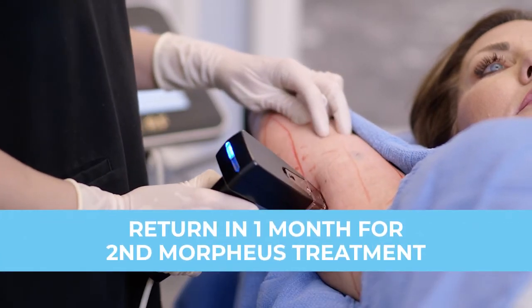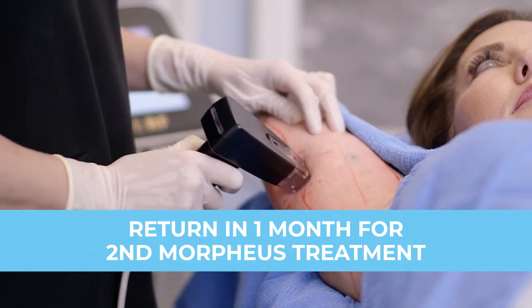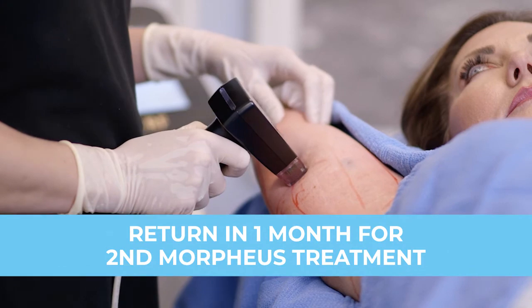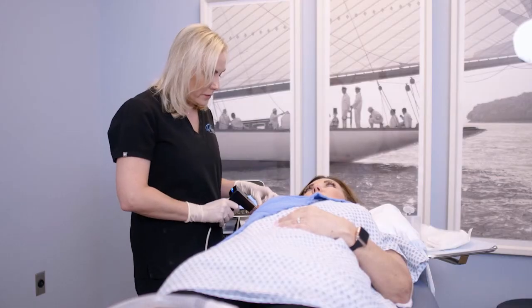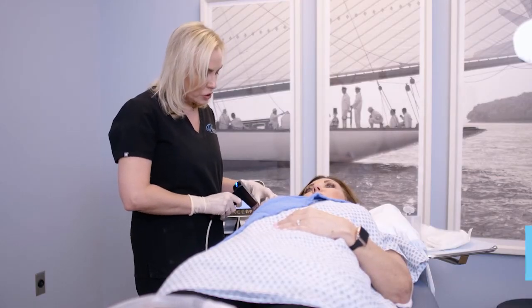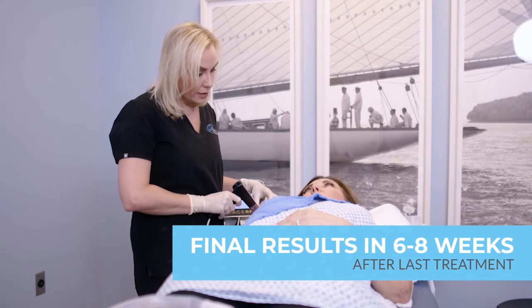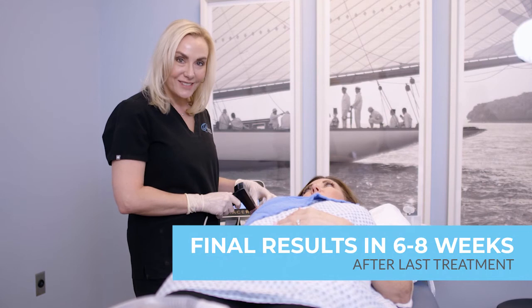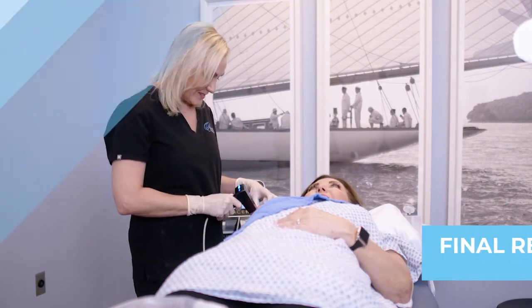Then we will bring you back in 1 month, and we'll do the second Morpheus treatment. We only do the body tight treatment once. Then we will be finished with both treatments, and we usually get you back at about 6 to 8 weeks from that final treatment, and we'll take after pictures and be excited about our results.